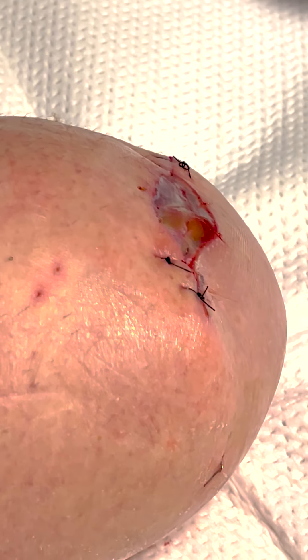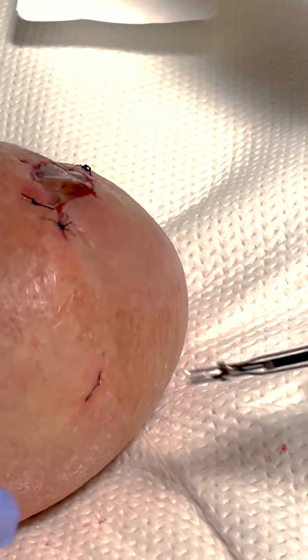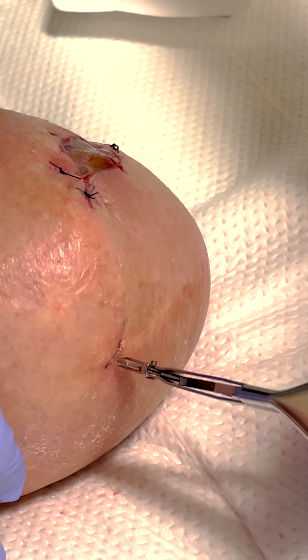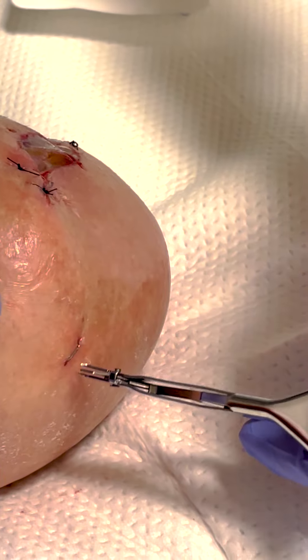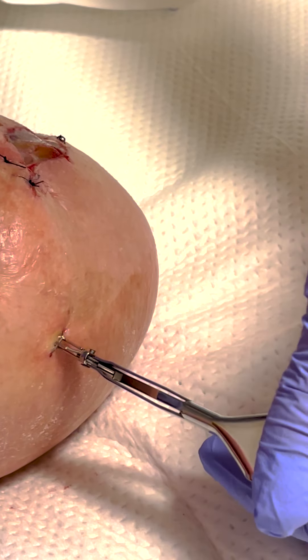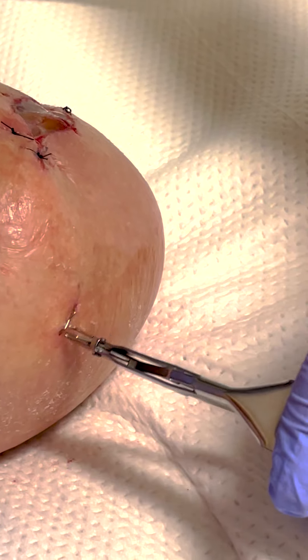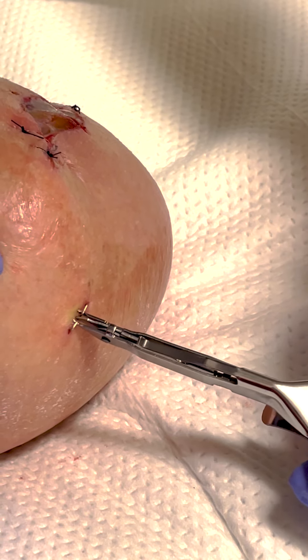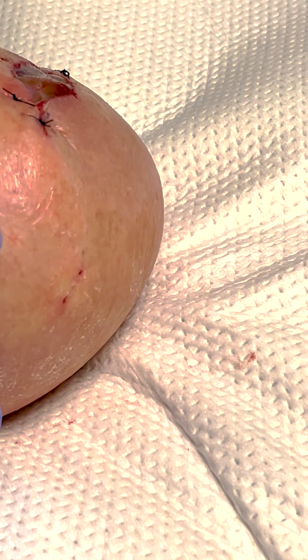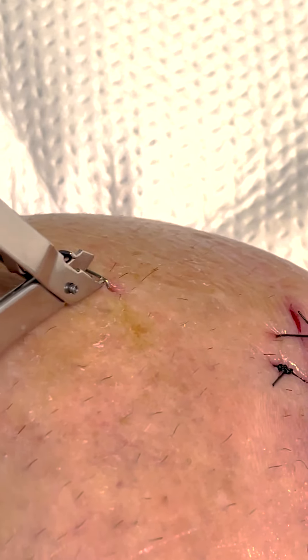There's one — that's cool, that didn't hurt at all. I did have some morphine given to me because the one that got yanked out actually hurt pretty bad. So that's cool for anybody who hasn't seen how a staple remover works — it just kind of pulls the staple out. Sometimes they hurt, sometimes they don't. I've had a lot of staples over the last couple of years.